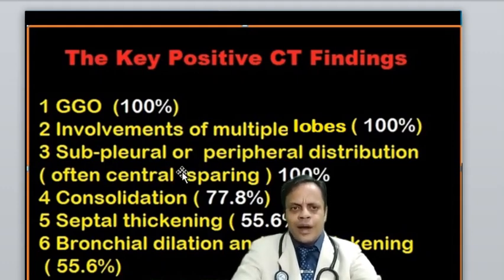During the pandemic, I have seen anybody posting some x-ray and people saying GGO, it's not like that. GGO has been there since a long time. So these are some findings. Right now I will not be able to explain all the findings, but these are the important ones. GGOs are found in 100% of cases.